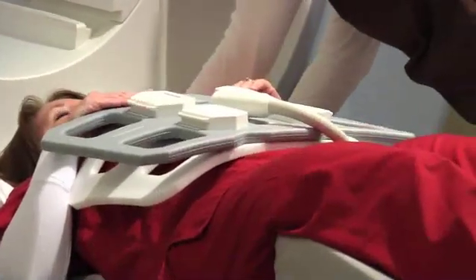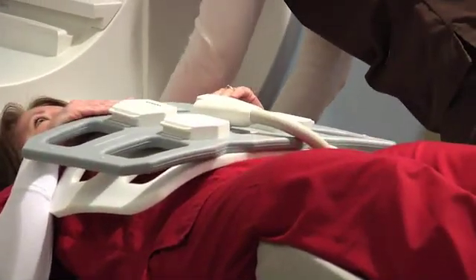Once positioned on the table, a coil will be placed on your abdomen. A coil is nothing more than a fancy antenna that collects the MRI data.